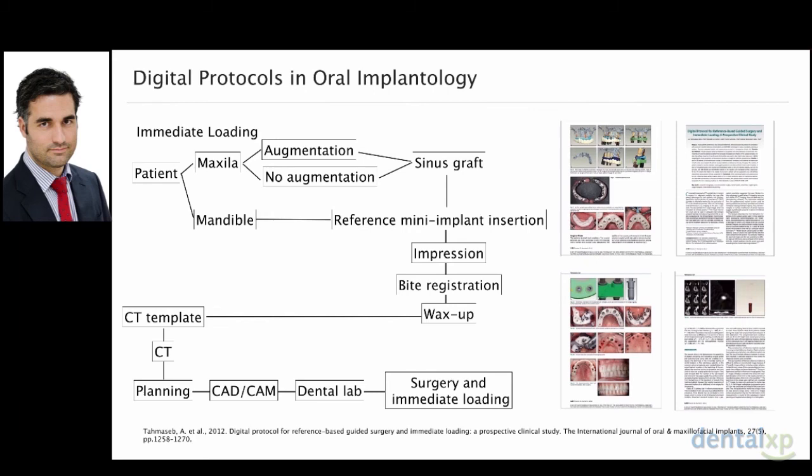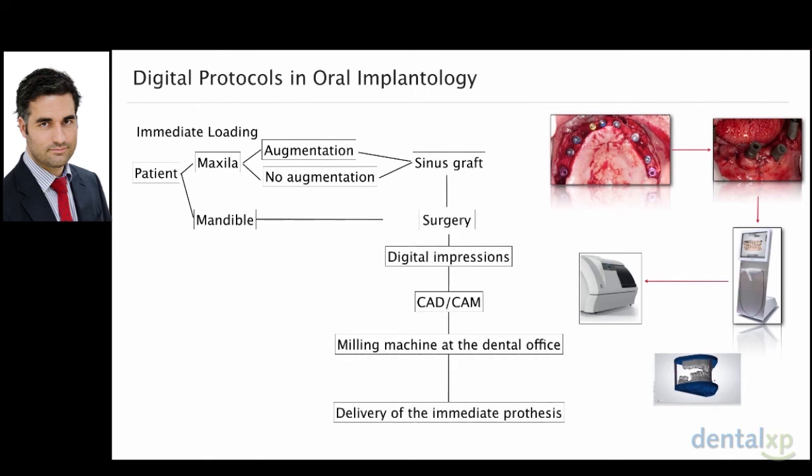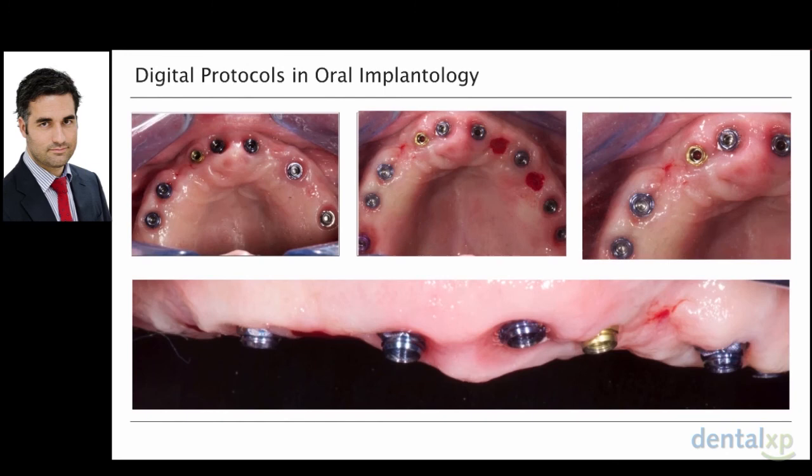Of course, this is a good option, but I think there will be other options in the future where you can do a digital impression in your dental office, and on the same day, with a milling machine in your office, you can get your PMMA prosthesis at the same moment. But this is the future, and something that I am working on now, and I hope soon to have some results.